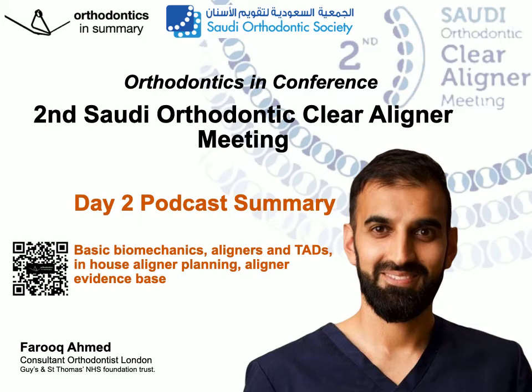He went on to finally describe protraction and using a hybrid Hyrax. 2 TADs in the anterior palate again, this time with expansion from the Hyrax screw, but also using the Alt-RAMEC protocol for expansion, which essentially involves expansion for a week followed by constriction for a week over a period of 7 weeks. This is thought to loosen the sutures of the maxilla, so if we were to apply a protraction face mask as well, we'd get greater anterior-posterior movement.